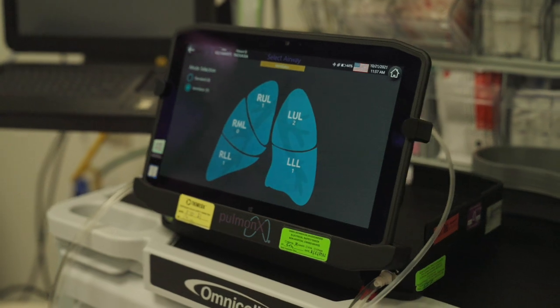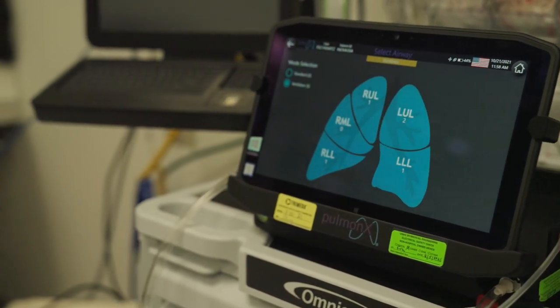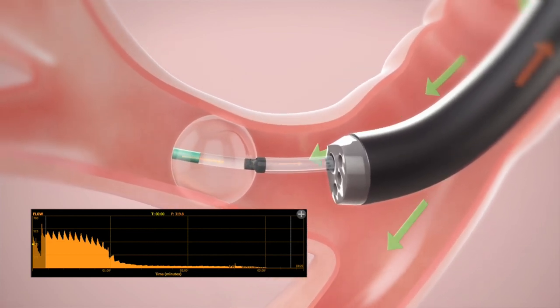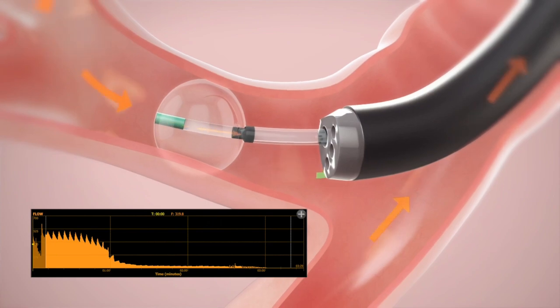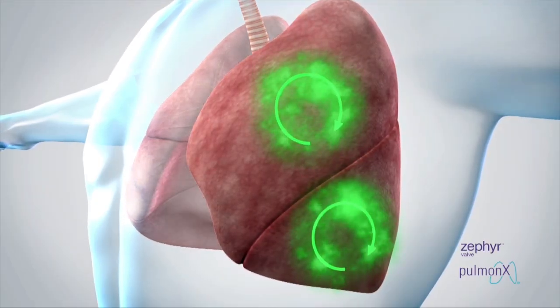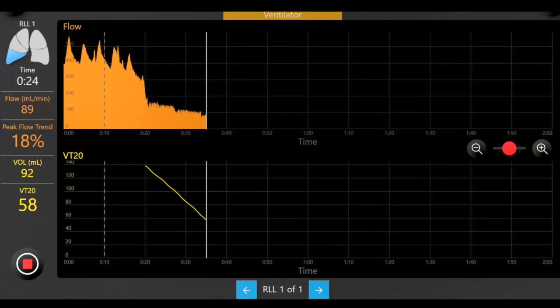So what that involves is using a system called the Chartis system. So what we do with our Chartis assessment during the procedure, just prior to placing a valve, is we blow up a balloon in an individual lobe of the lung and assess flow of air. If there's no collateral ventilation between the lung lobes, then eventually over time, the amount of flow being detected by that system and that balloon would cease. And that is a good indication, a very sensitive and specific indication that there's no collateral ventilation. If that's the case, what we end up doing is then moving forward for actual valve placement.